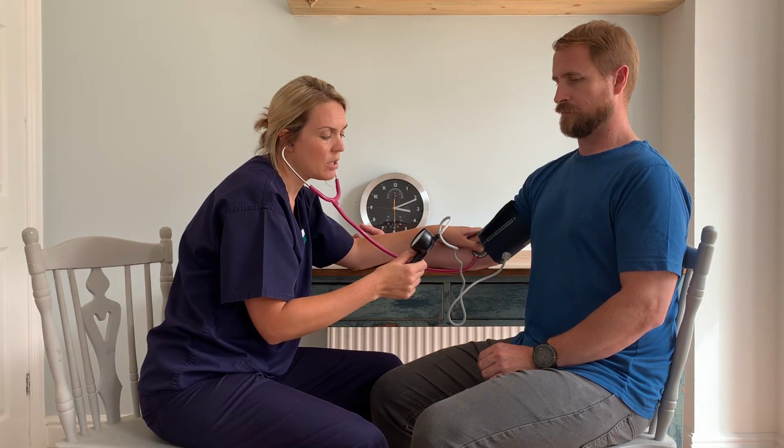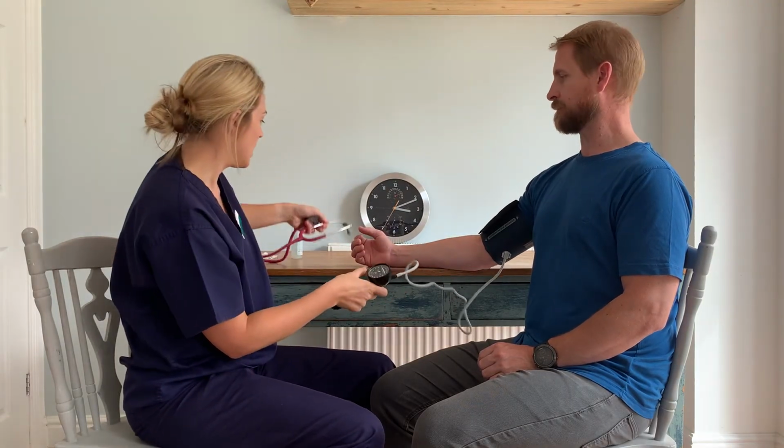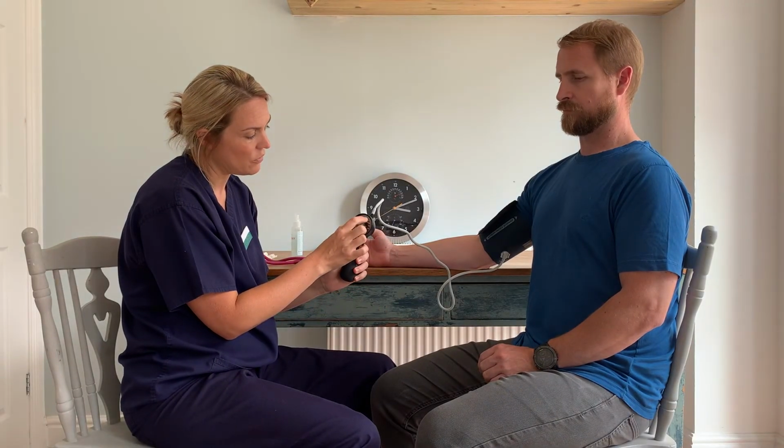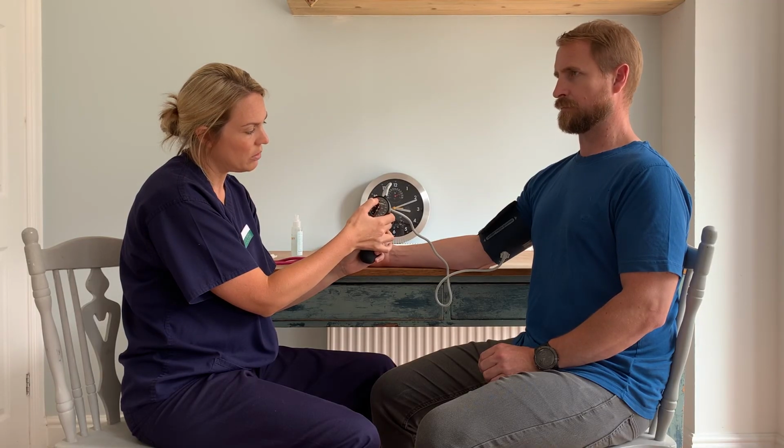So that was at 62, I stopped hearing that sound, so I can now release the rest of that air out. Okay, go and move the stethoscope. So what I was doing there was releasing the air slowly from 150, watching that gauge all the way round, and waiting for a dub, dub, dub sound. When I started hearing it, I made a note of that number. That's the systolic blood pressure. Then as I continue to hear those sounds, I release the air ever so gently and slowly. And when you stop hearing those sounds, that's the diastolic blood pressure.